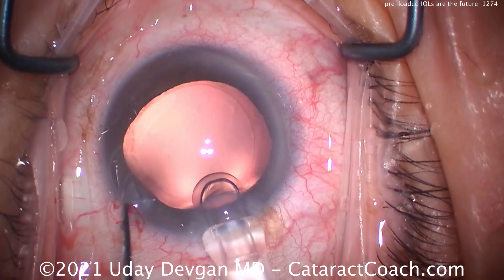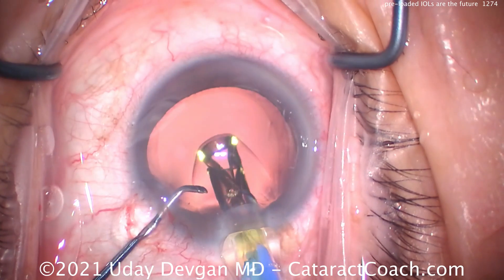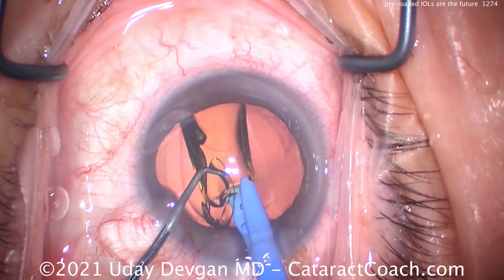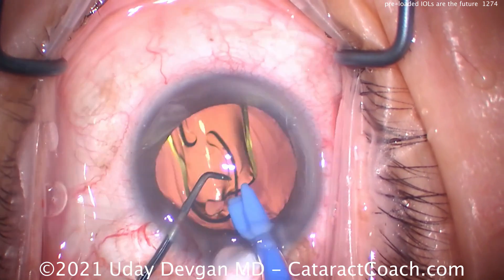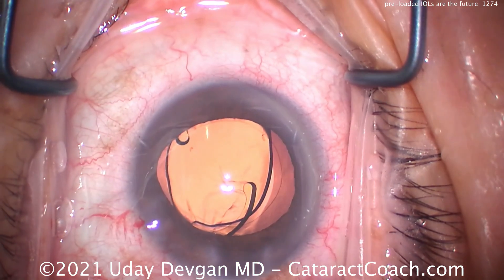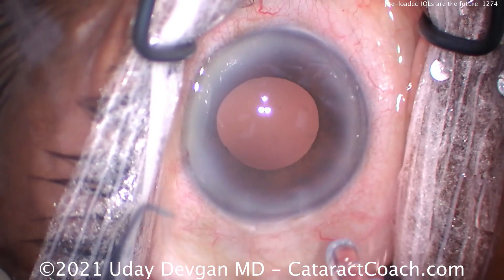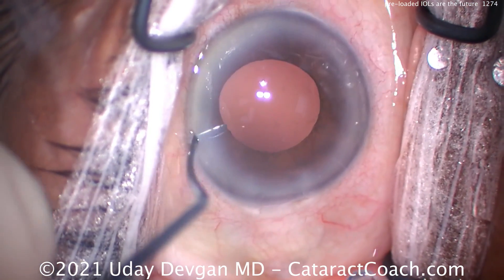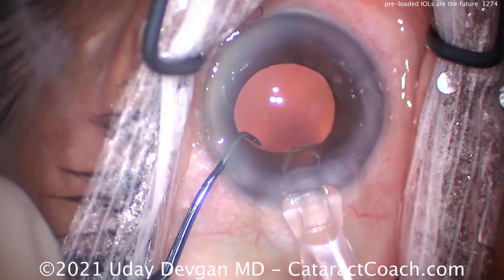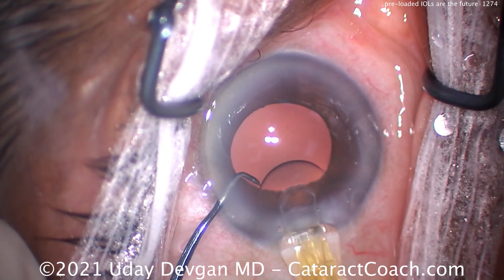I think all manufacturers are going to basically come out with preloaded lenses, and we already see it from many. Alcon had a previous Ultracert, now they have this one. Bausch & Lomb has a preloaded one, Johnson & Johnson — I think all the companies essentially already have or will have preloaded injectors. The nice part is there's no manipulation of the lens; you don't have to manually load it, there's less handling.